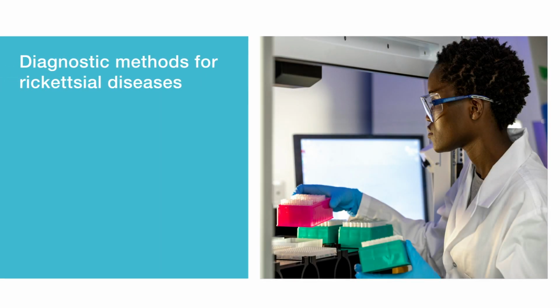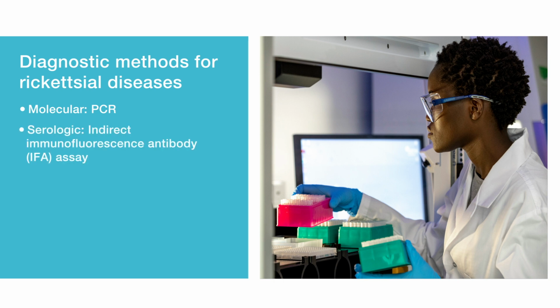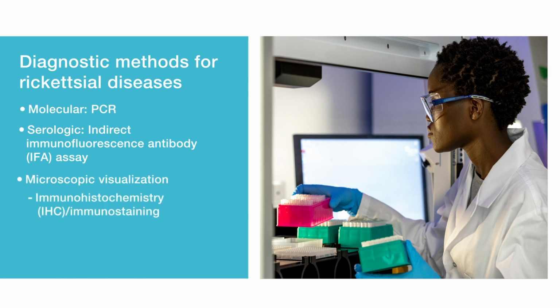Various laboratory methods exist for the diagnosis of rickettsial diseases. Methods differ in availability, type, and timing of specimen collection and interpretation of results. Molecular methods such as PCR and serologic techniques are the most commonly available methods of testing for rickettsial diseases and will be discussed in further detail. Microscopic visualization such as immunohistochemistry and peripheral blood smears, as well as culture, are additional methods used for rickettsial disease diagnosis but are less commonly performed.